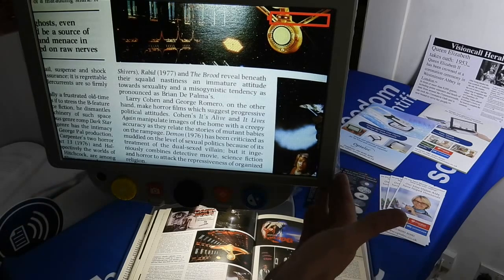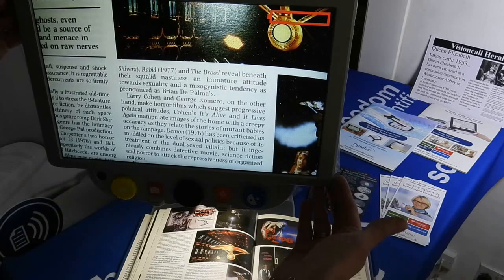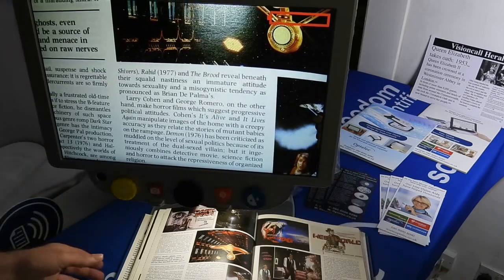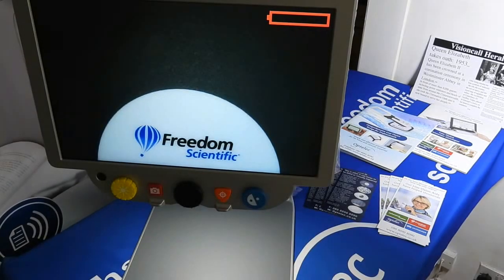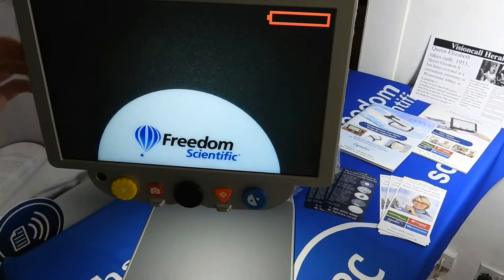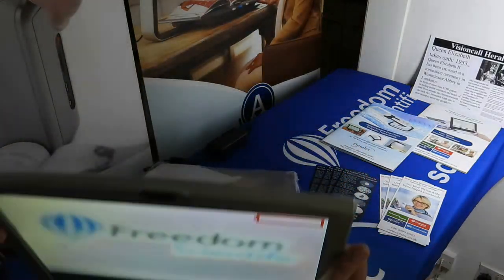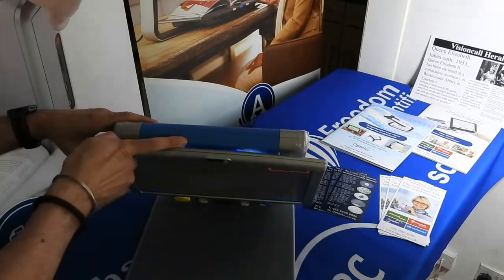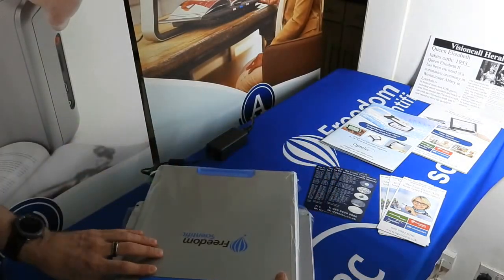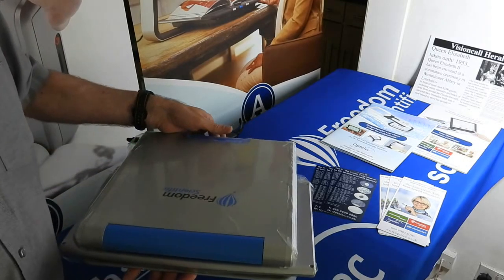It has a 15 inch screen, and it does come also as a 12 inch screen option. The whole idea is that the whole unit can be fully adjusted or quite simply folded down into a much smaller, compact size.